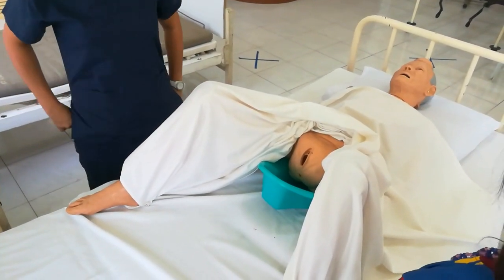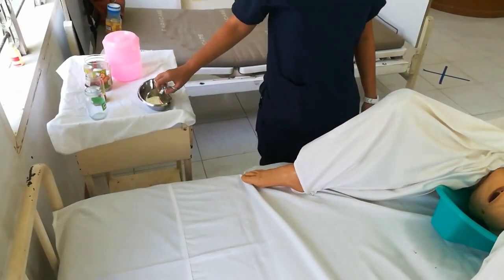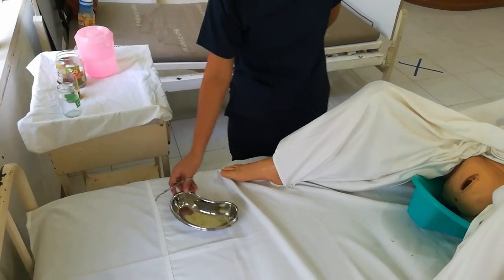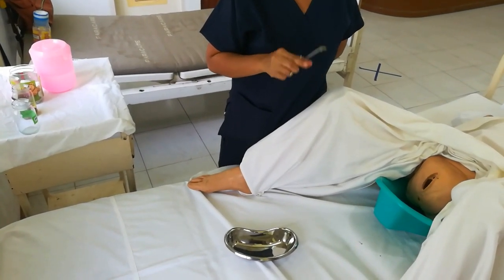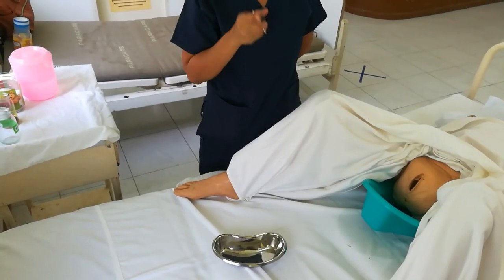Afterwards, you clean the perineal area. For a female patient, you clean using seven cotton balls with cleansing solution, using the pick-up forceps. The principle is to clean from the cleanest area to the less clean area.